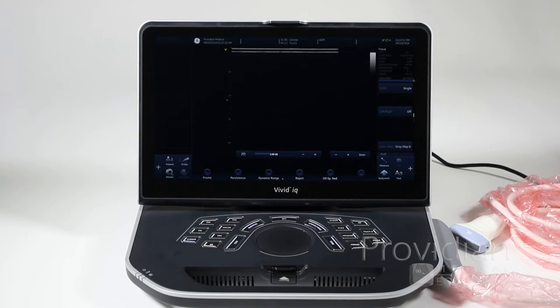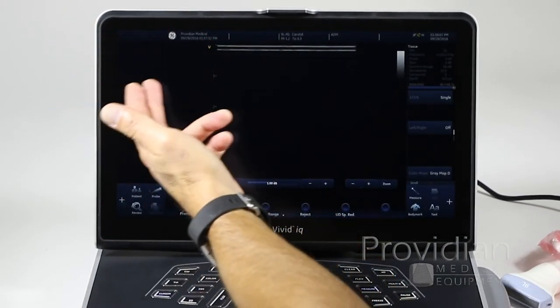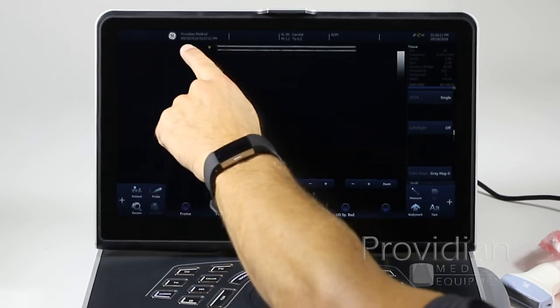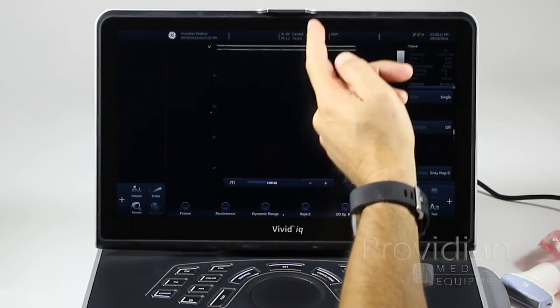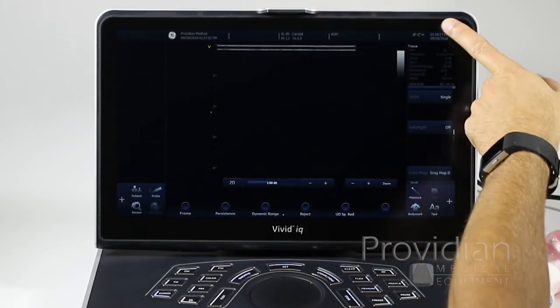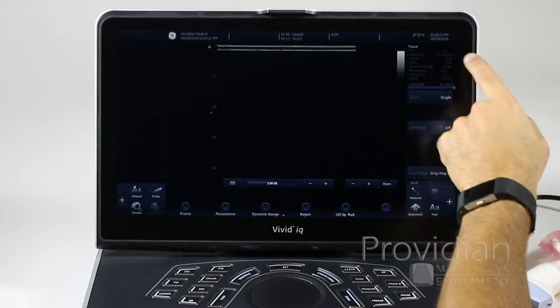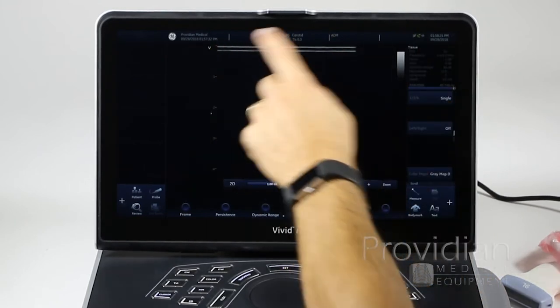If you haven't used a touchscreen ultrasound before, it works just like a tablet. You'll notice there's no keyboard — I'll show you how to get to that in a moment. Going around the screen: you have your facility name, which you entered in the installation wizard, date and time, the probe that's connected, ADM for administrator, Wi-Fi status, GE support, and whether it's plugged in. There are two timestamps — current time and when the exam started.